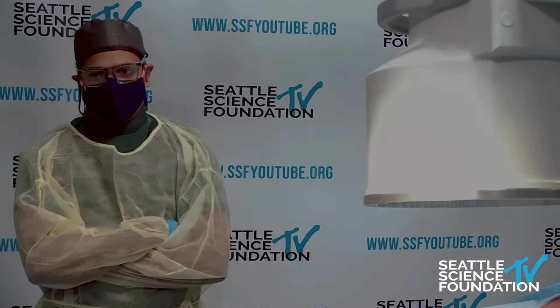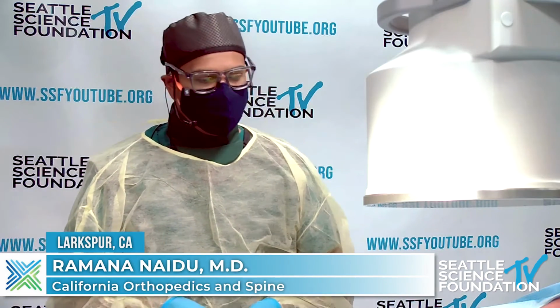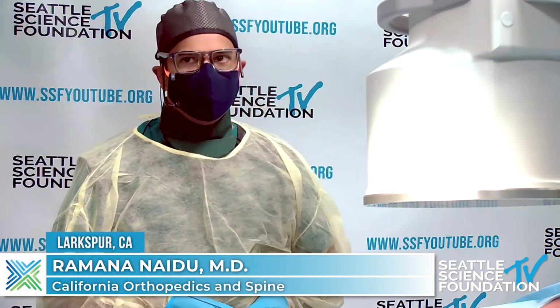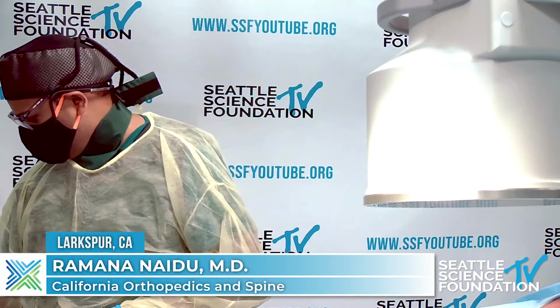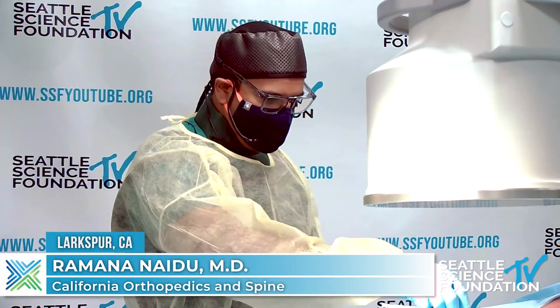I'm here today to talk to you about the only peripheral nerve stimulator system we're going to talk about today, which is with a specific company, SPR Therapeutics. What's unique about this system is that it basically has a microfilament lead. It's really, really tiny. I don't even know if you're going to be able to see it on the camera, but I'll just lay it across the skin here.